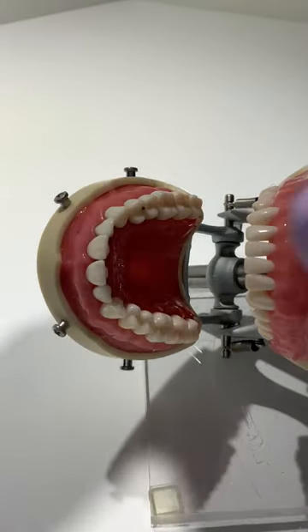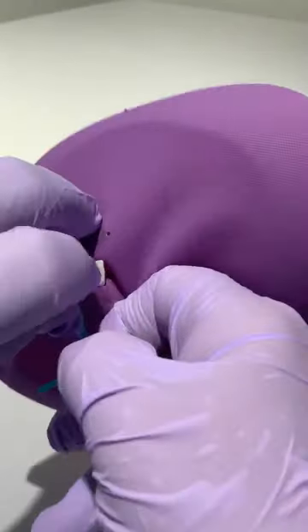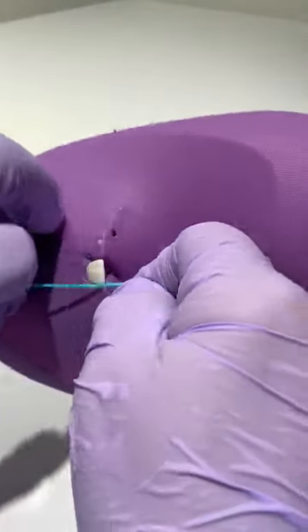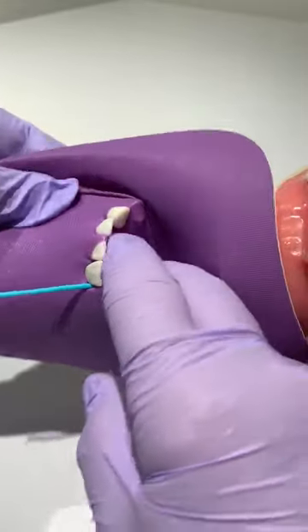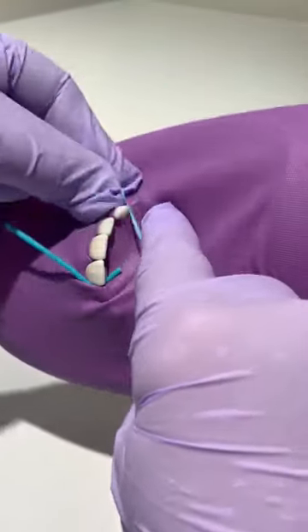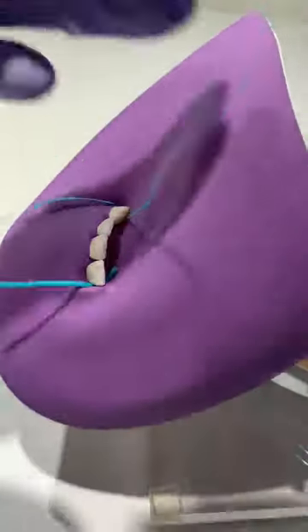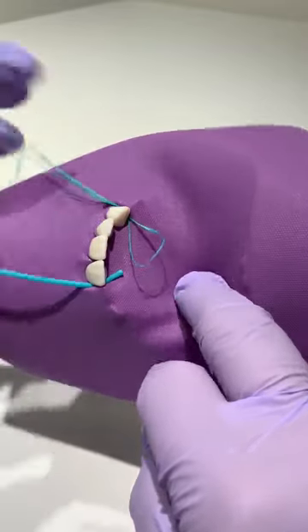The dam is taken to the mouth and a Wedget cord is used to anchor one end of your isolation. The dam is stretched over the remaining teeth. For tight contacts, use wax dental floss to carry the dental dam through the contact, making a loop on the lingual.